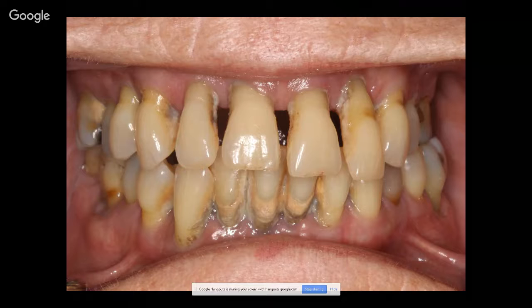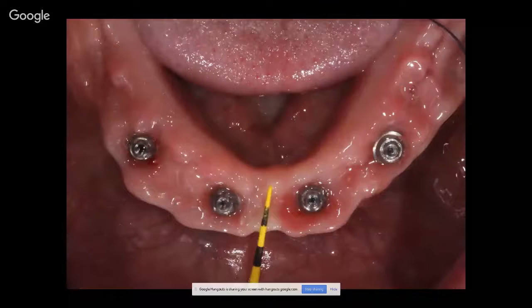So to take a patient to go from here that has obviously bad periodontal disease, lots of bugs, soft tissue will retract in these areas. I will have some soft tissue issues, and immediate load. So this is my new protocol. Immediate load our implants, and be able to obtain a predictable 6 to 9 millimeters of soft tissue around our multi-unit abutments on an immediate loaded full arch fixed case, and have a predictable restorative outcome that is prosthetically, surgically generated, and has a very high long-term success rate, using the multi-unit abutments that I purchased.